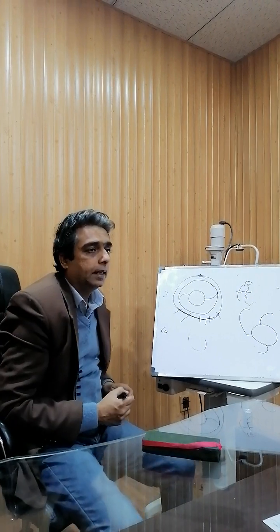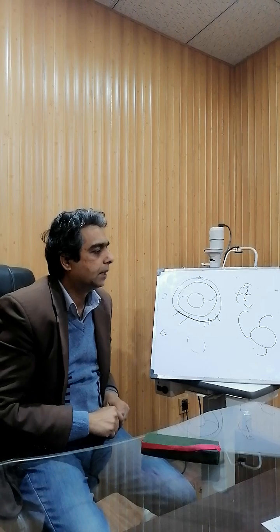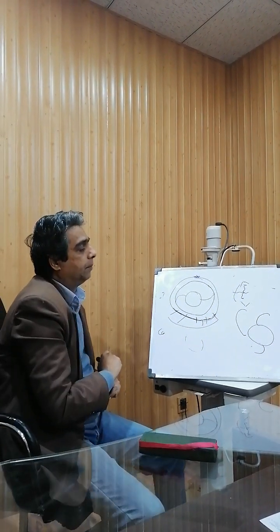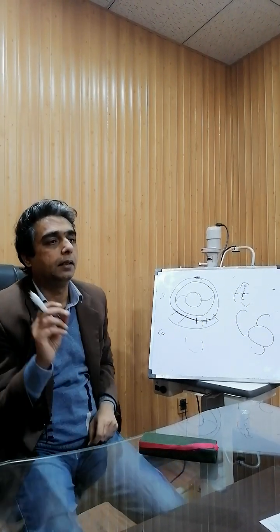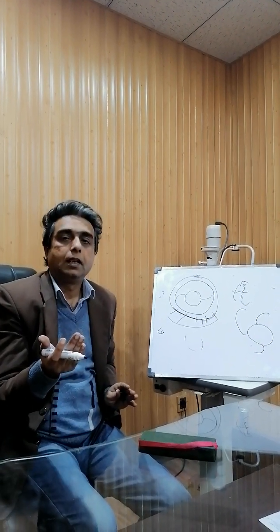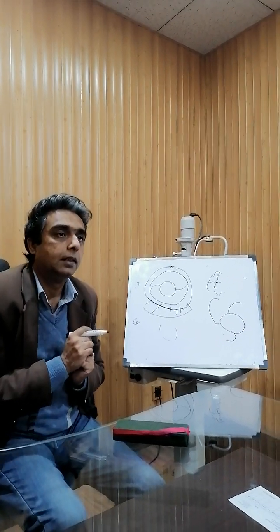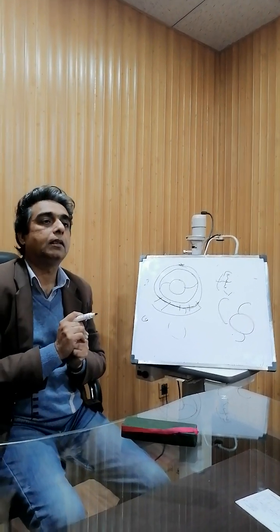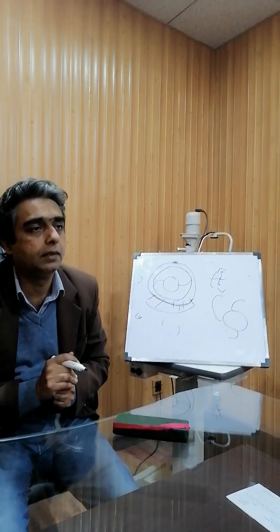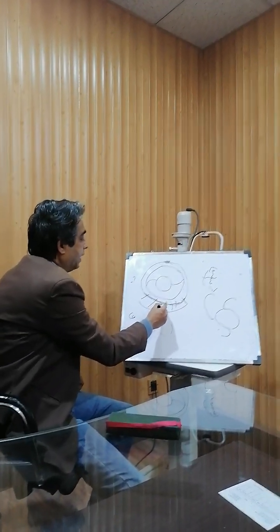Then we will pad the eye. The next day we will open the eye. The patient may see 6/18 or so. Then after 40 days we will remove the 5 sutures, because any suture might be loose, any suture can be tight. They may produce astigmatism, and this is the thing. Two things led to the invention of phacoemulsification. One thing, besides the wonderful surgery, the patient's vision is not that improved, because astigmatism is so high, because a suture is, for example, so tight.